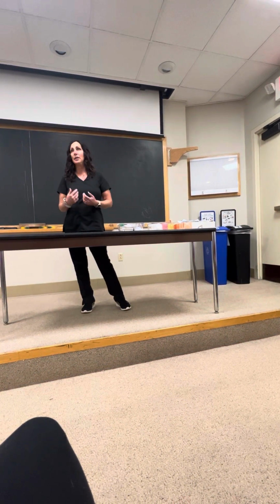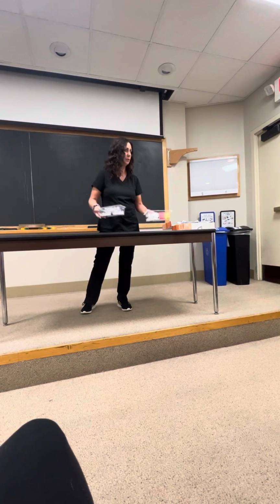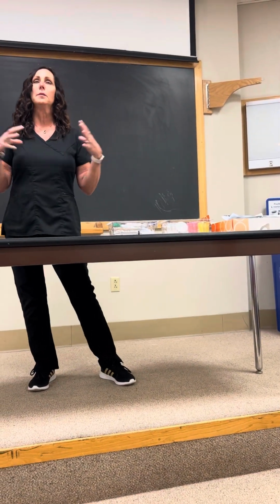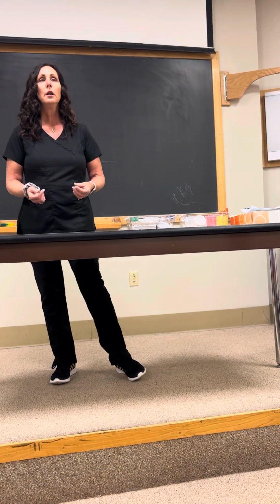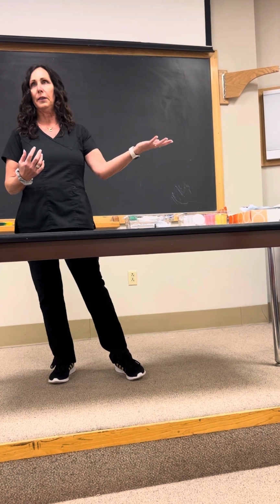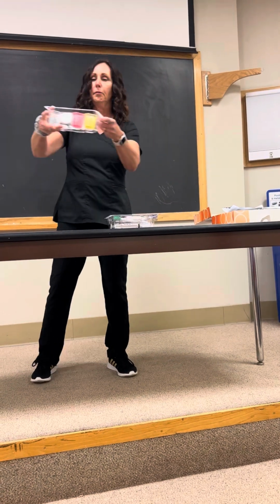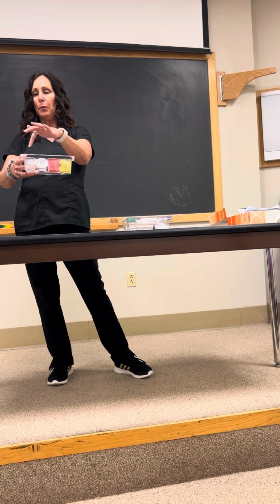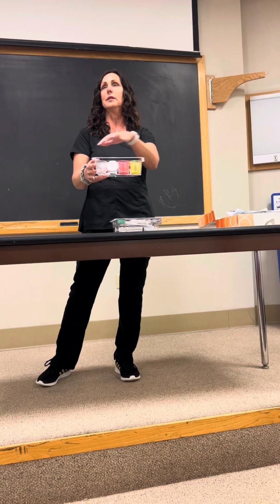Marrow tends to be very sticky. It likes to clot very easily, so there are a couple of sterile trays that come in our kit that you will all be dealing with on the field. It's really important that everything that comes into contact with bone marrow gets saturated with heparin first, or coated with heparin, if you will. So they will go ahead and get the heparin for you. That gets opened to the sterile field. This portion of the kit has sterile cups in it, so it makes it real easy to decant your heparin and the anticoagulant that we use for the actual draw into these sterile cups.